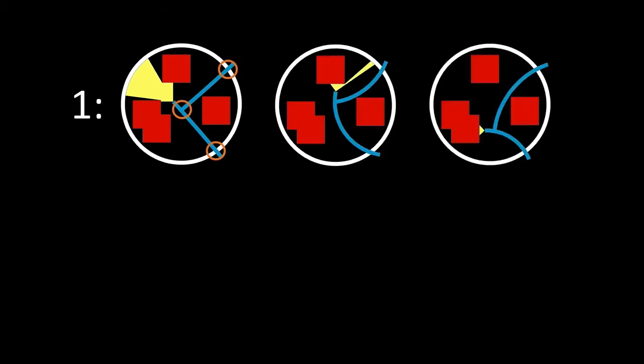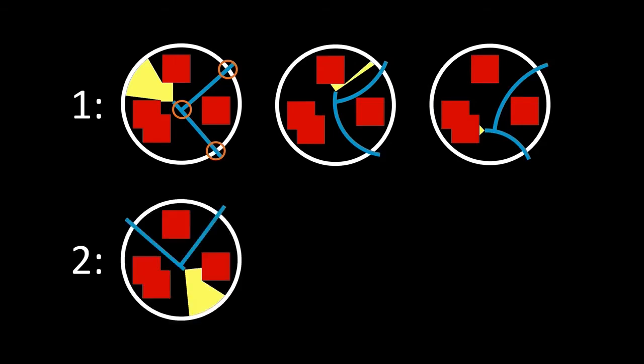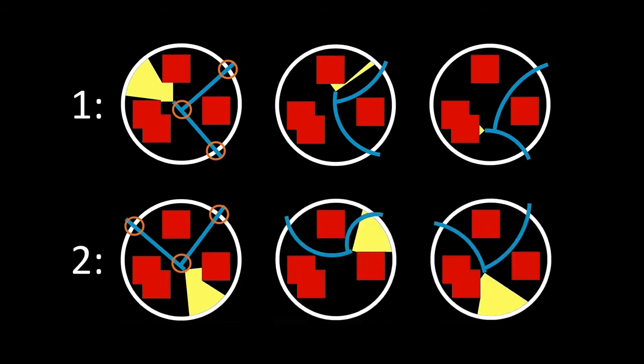With the robot entering the body at these points and with a snare grasping location as shown, the robot is not capable of visualizing much of the interior surface of this scenario due to the constrained motion caused by the red obstacles. If, however, we consider a different design with entry points here and a snare grasping location here, the robot is capable of visualizing a much larger percentage of the interior surface as it moves in a collision-free manner throughout the space.